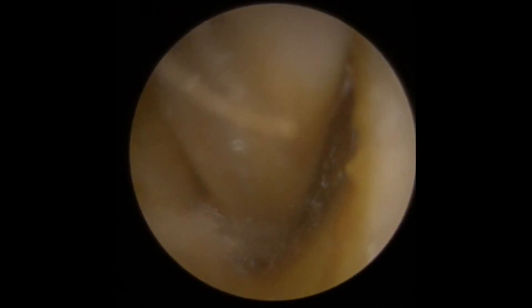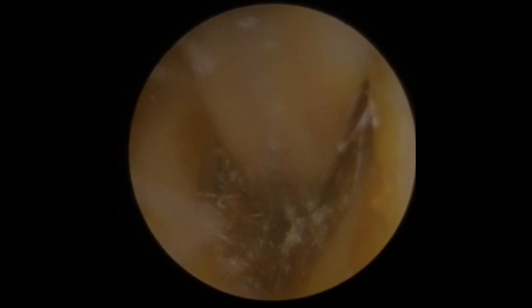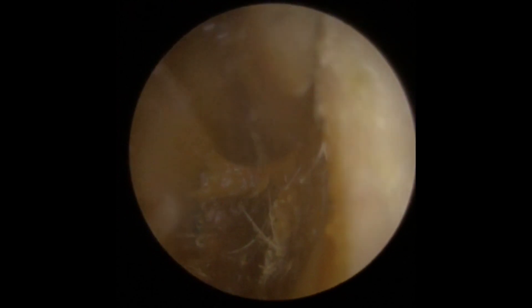When we go back in, the wax is stuck to the right-hand side of the canal wall and encroaching over the top of the eardrum. So what we're going to do first is try and unstick it from this right-side canal wall — the piece of wax closest to the camera — just gently trying to lift it off the wall without touching the canal wall if we can, lifting very slowly and manoeuvring it away. The canal walls can be quite sensitive for some people.